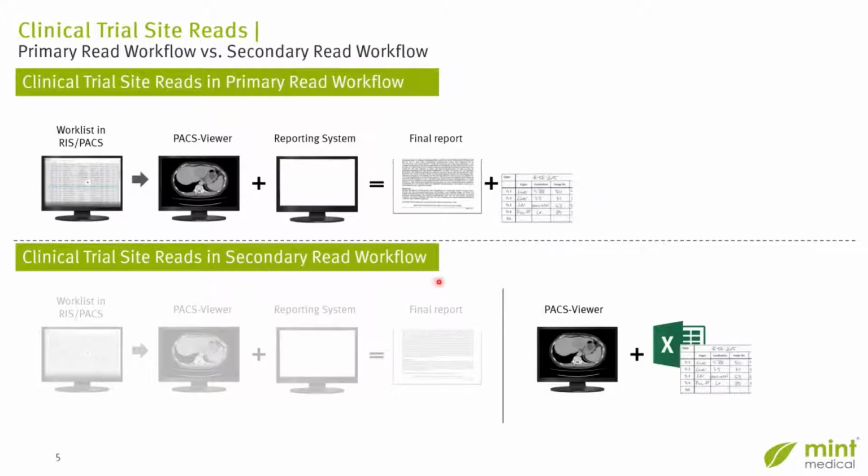Another scenario is to do the site read in a dedicated secondary read workflow independently from primary routine read. Actually, the majority of our sites we are in contact with worldwide apply this secondary read workflow. I think there are pros and cons for both scenarios, but I believe the most important argument for a secondary read workflow is the expertise that is required by the radiologist who performs those site reads.